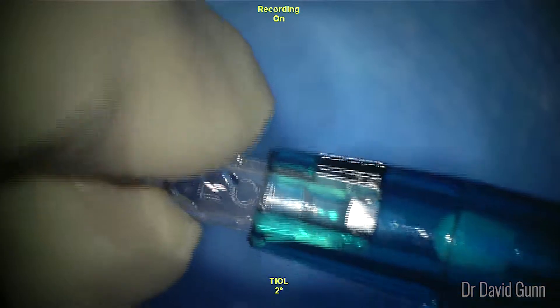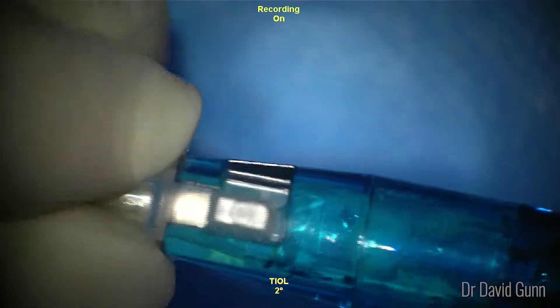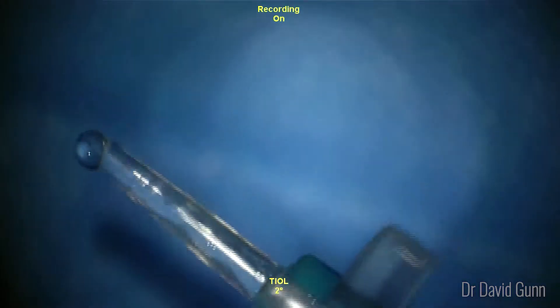The cartridge is then inserted into the handpiece, which has been pre-wetted, and then the plunger is advanced just to the very tip of the inlet.